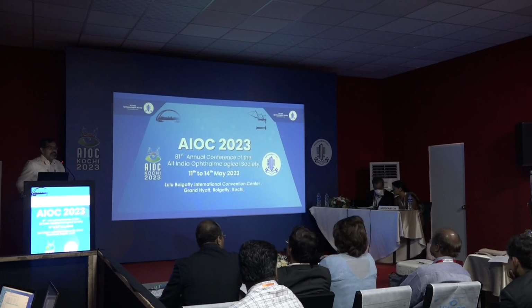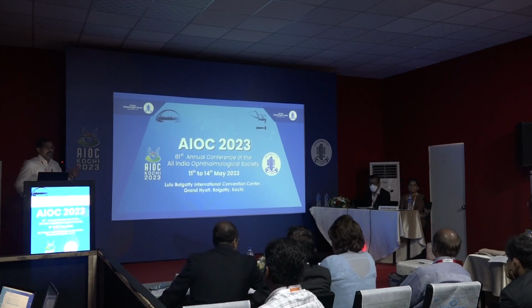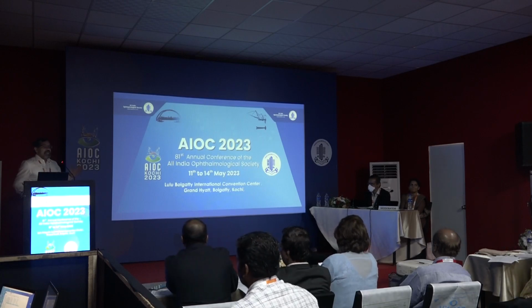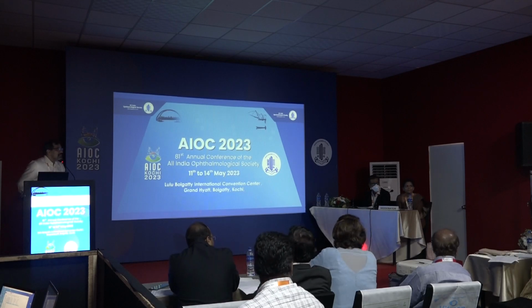It's very risky to put toric IOL. People pay so much. It's very risky. You get some error. So it will measure the axis of steep axis. We have come to the most important question. There's hardware and software involved.